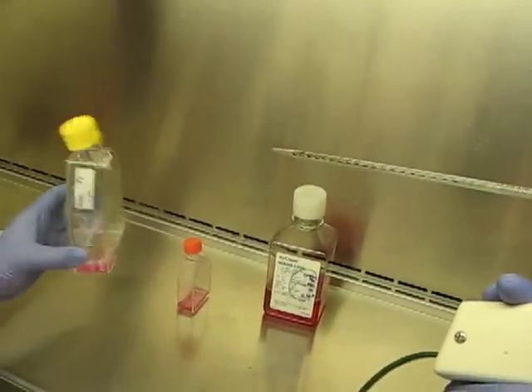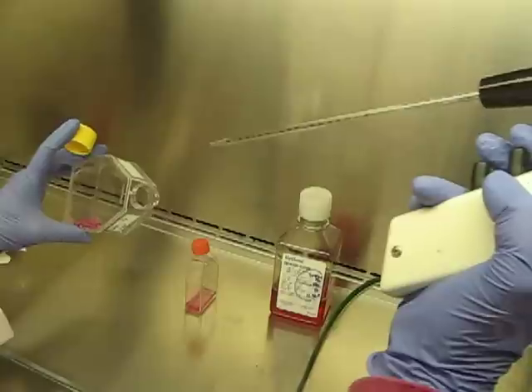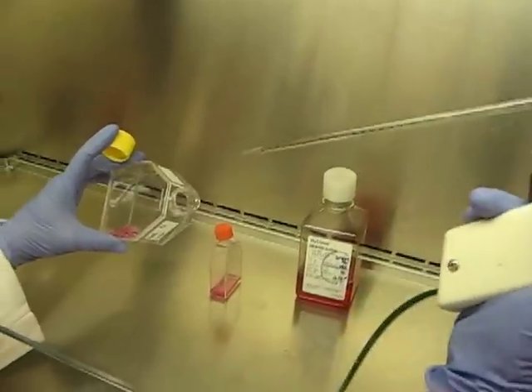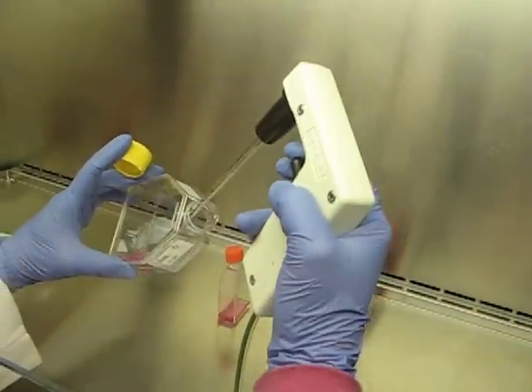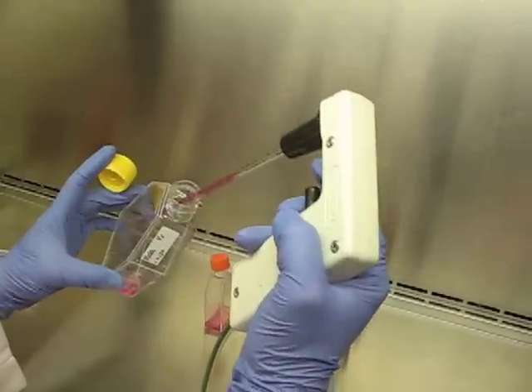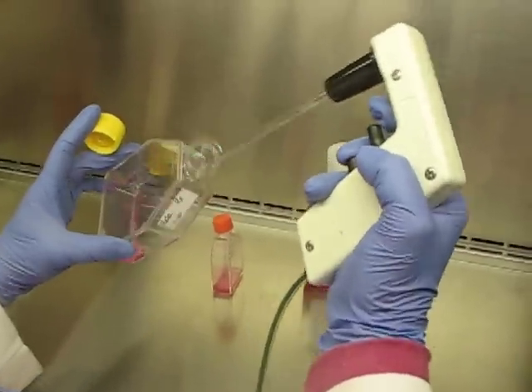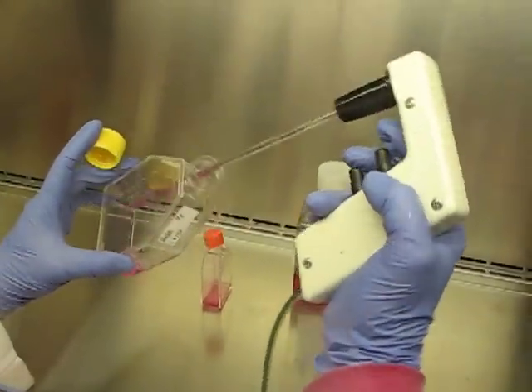These cells have been sitting here for about five minutes, and cells fall out of suspension very quickly. So you don't want to just open this up and take one mil. What you want to do is pipette up and down to make sure you have a homogeneous suspension.